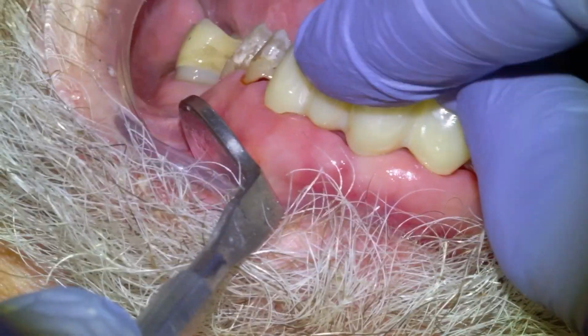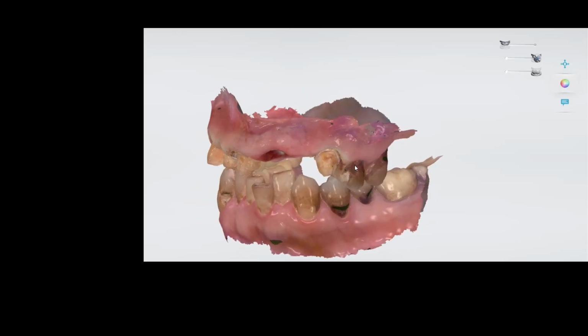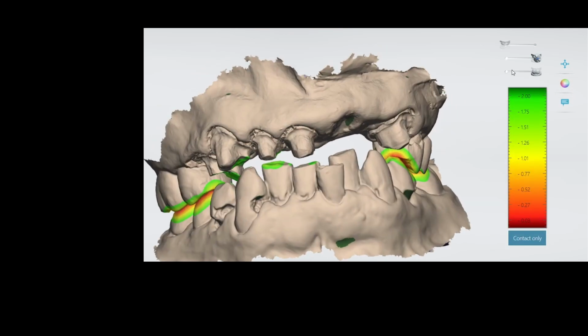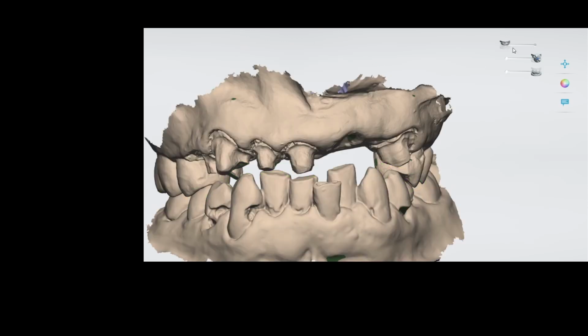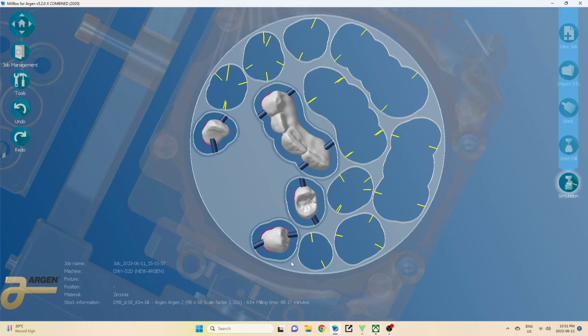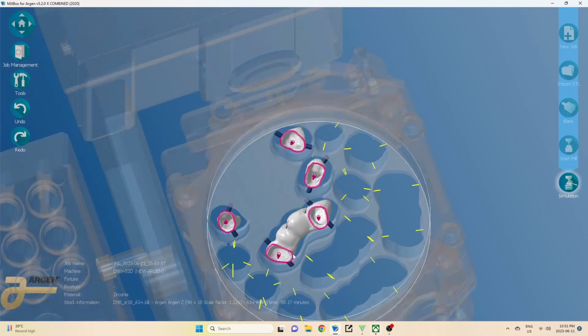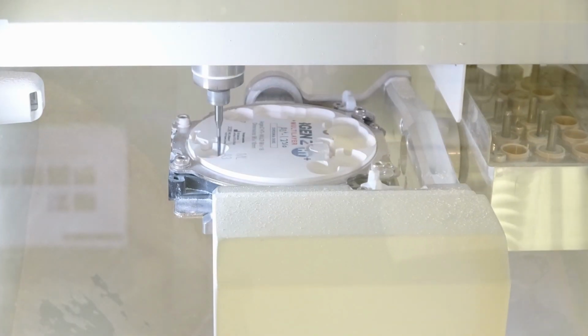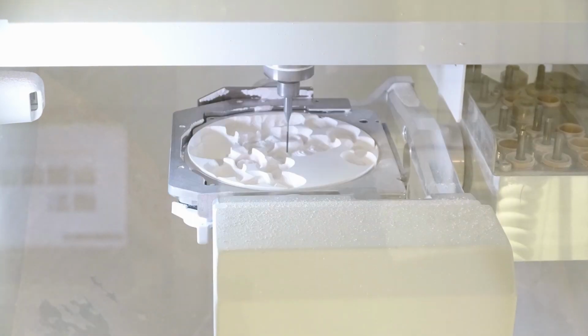So once we've prepped the teeth, we're going to take a scan, and I usually like to have a good 1.5 millimeters of clearance for zirconia bridges, which we had. We're going to send that off to my designer, and he's going to design these parts for me and send them back. I'm going to plug them into the milling machine. Here's the milling machine milling the parts out. This is about a 4-hour mill.